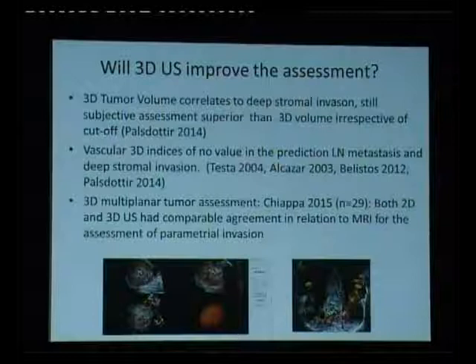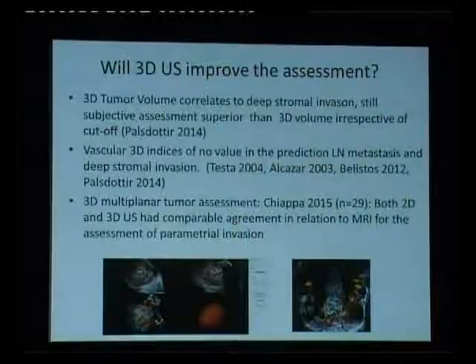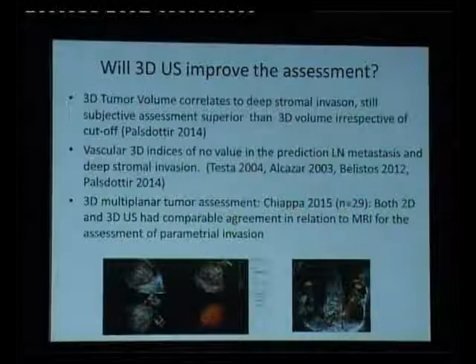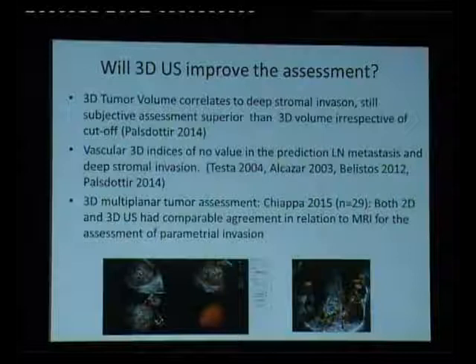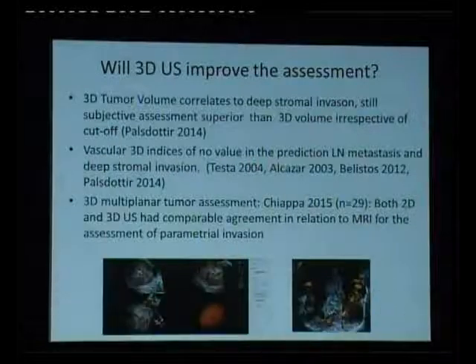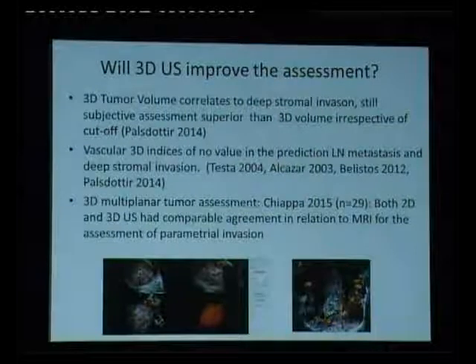What about 3D ultrasound? Will it improve the assessment? We did a study on 3D ultrasound to determine how well it correlated with advanced disease. We found that 3D volumes correlated to deep stromal invasion. Still, subjective assessment based on the 2D image was superior to the 3D volume, irrespective of cutoff.